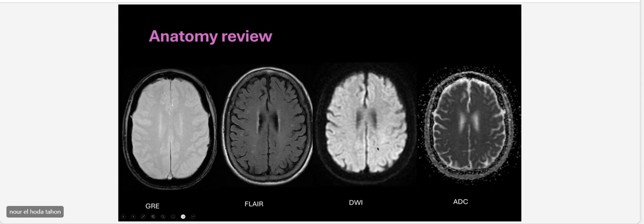So we talk about, do you know which molecule, which element is the most famous in our body, the most prominent? Hydrogen. So hydrogen, and the hydrogen is part of which molecule, do you know what it is? Okay. What's the, like 70 percent? Yes, water. Exactly, water. So most of our body's component is water, right?